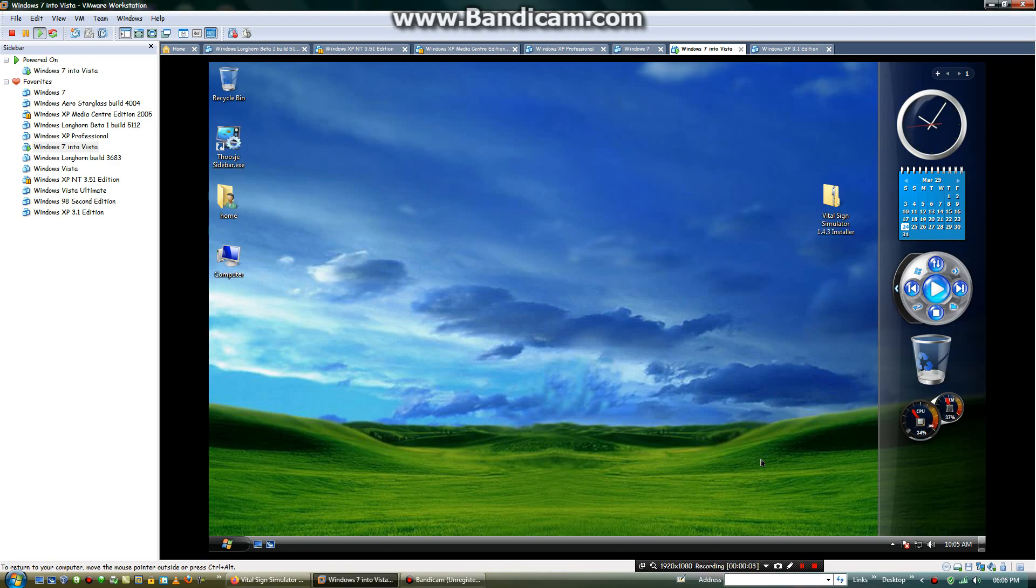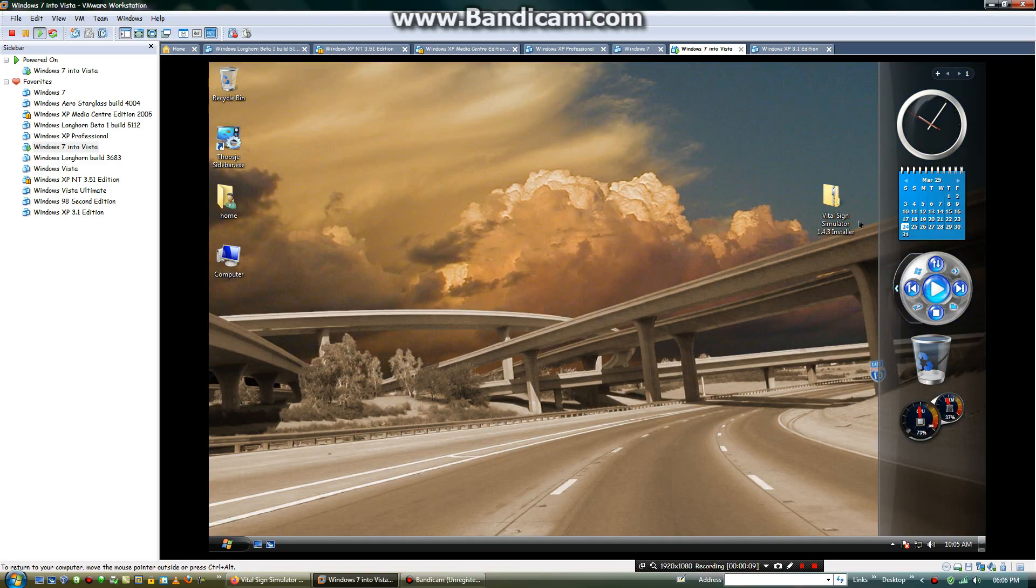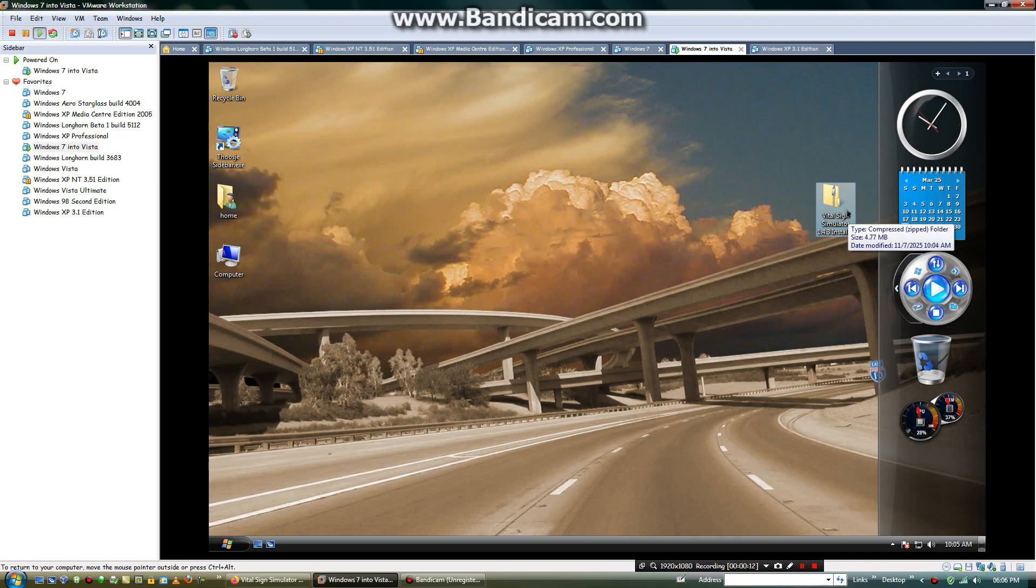Hey there, this is Alex Slide and in this video I will show you how to use the Vital Sign Simulator. Now this software is a patient monitoring software. I will show you how to use this.